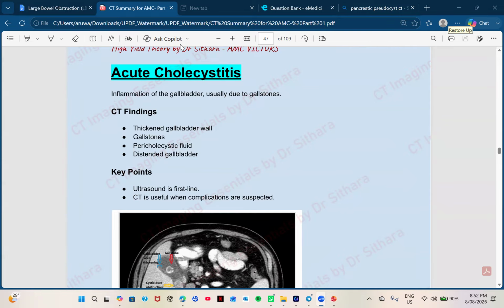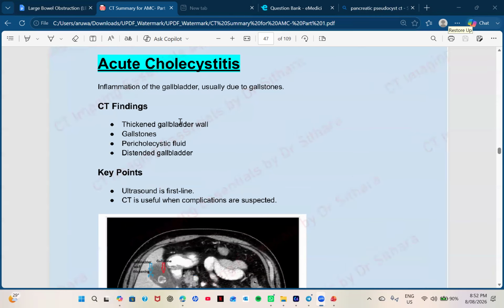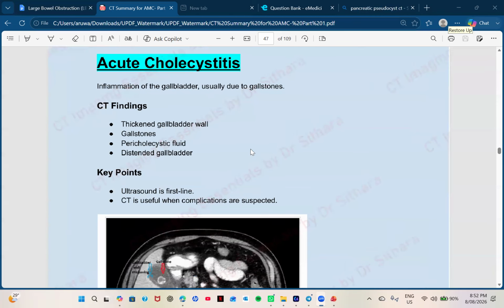What gastric outlet? That is not necessary here, right, doctor? So that's a separate thing. So you're asking gastric outlet from pseudocyst. Oh, what is? I don't get it. So we'll discuss this one first, right? Imaging part, doctor, because a lot of things I have to explain. And yeah, after session, if I have time, I will explain. So for now, we'll focus this one, okay?